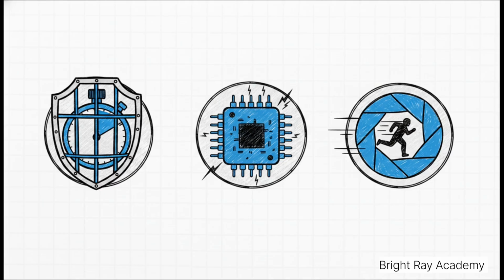But for your actual exposures, we have incredibly accurate options capable of intervals as tiny as 1 millisecond. While older systems use these motor-driven synchronous timers, modern equipment relies on microsecond-fast electronic timers, or MAS timers. These are specially designed to calculate the highest safe tube current for the shortest possible time to hit your desired MAS target, which really helps reduce patient motion blur.